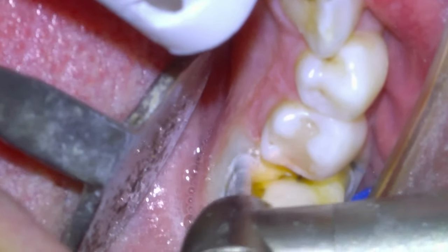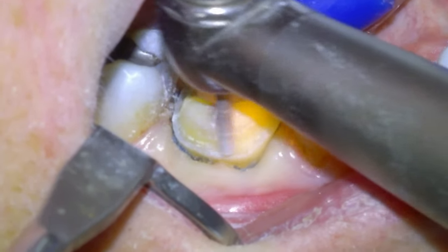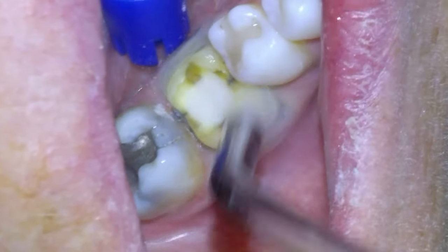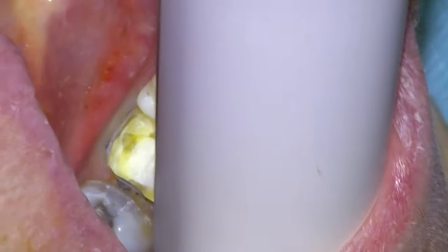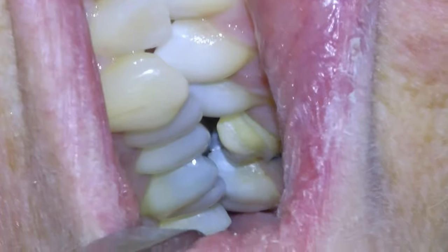I'm going to pack a size one cord around from the mesial buccal to the distal buccal until we have clear visual access to all of our margins. Refine a little bit more — you don't have to have the water on. Then we're ready to take a scan. We're going to dry, rinse and dry, take a scan of the prep, take a scan of the opposing, and take a bite scan.